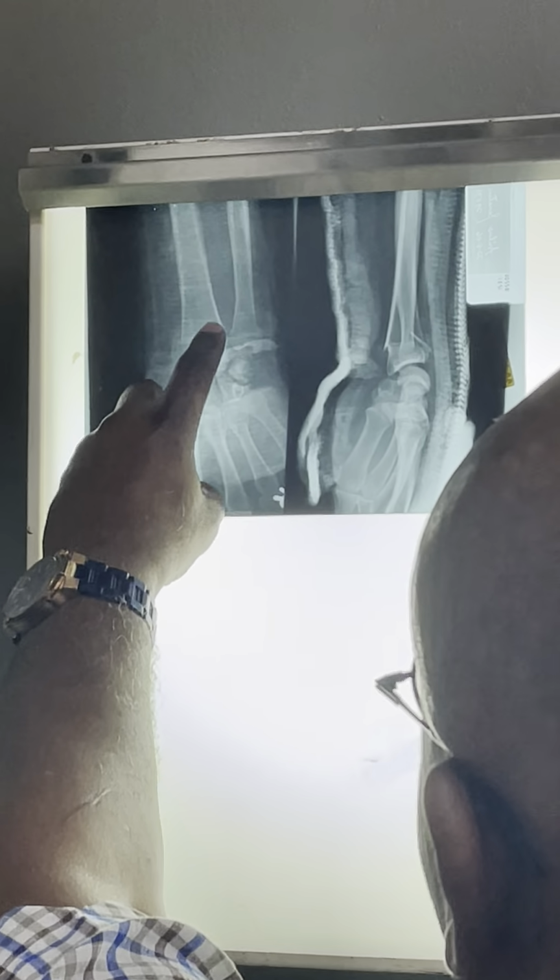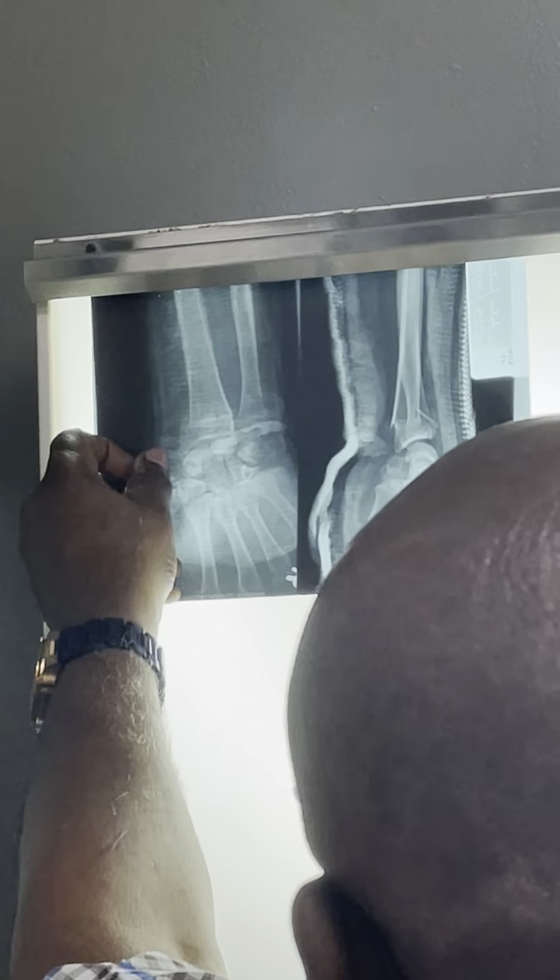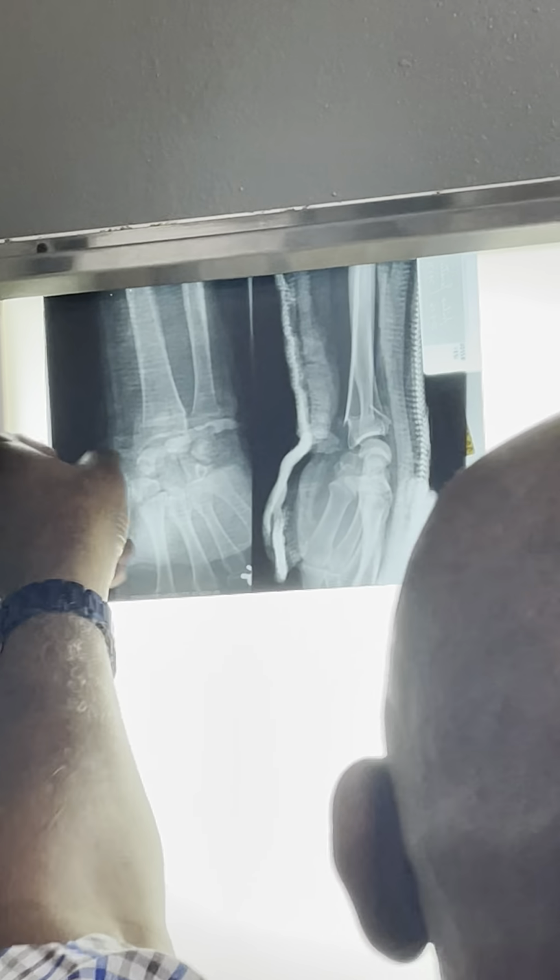You see how it looks. You can see how it comes back there now. You see how you can see the fragment, the cortex there now. But I mean, you can see it's not fully reduced here either, but at least it's attempting to. But maybe look at a good reduction.